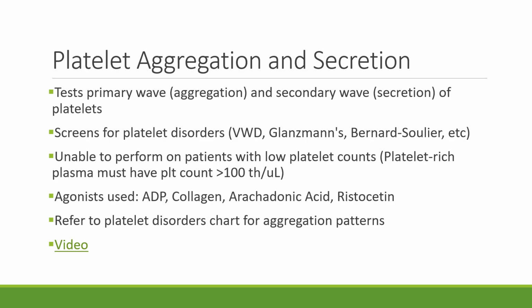It's pretty interesting. The interesting thing that I love about platelet aggregation, although platelet aggregation testing does take some time, is that we can actually see the pattern of aggregation happen in real time. We utilize little glass cuvettes. It is a spectrophotometric measurement, and when you're done with the testing, you can pick the cuvette up, look at it, and see macroscopically the aggregated platelets, and it's just really neat. We also get a real-time graph of platelet activity in response to each of the agonists. So I think it's a really fun and neat test to look at.